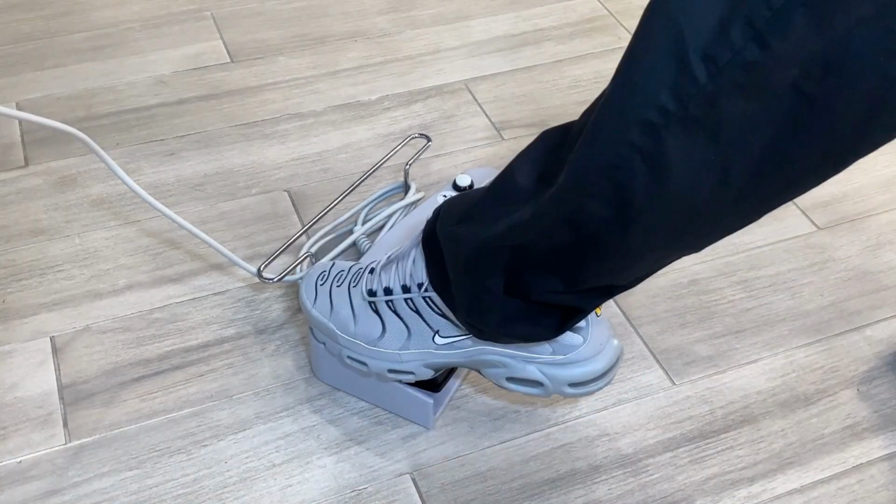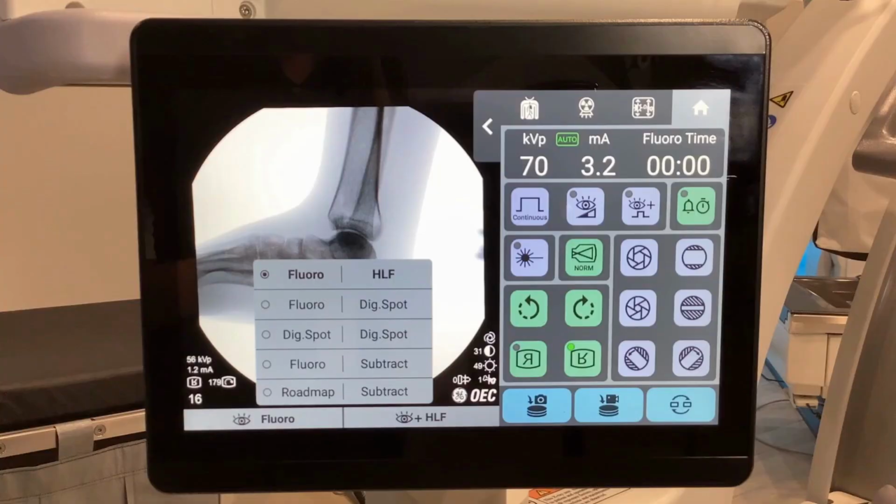Press the Mode Switch button to toggle through the available imaging modes on the system. Mode pair changes can be seen on the status bar of the touch control panel. Mode pair options depend on software configuration.